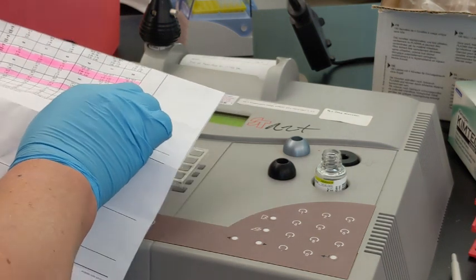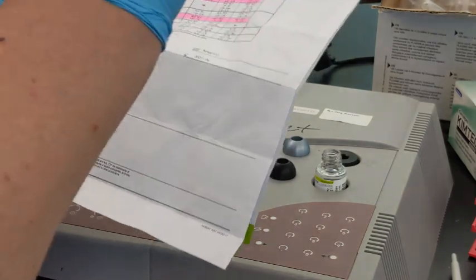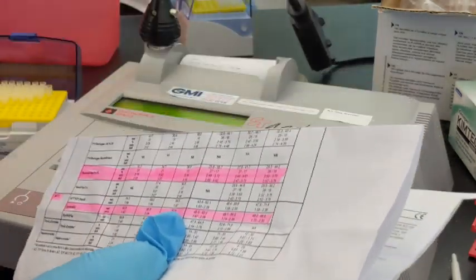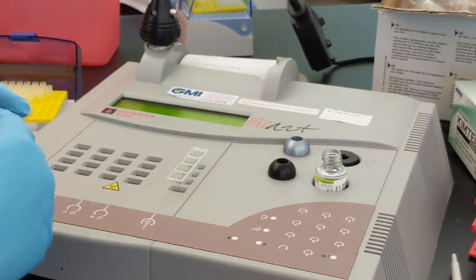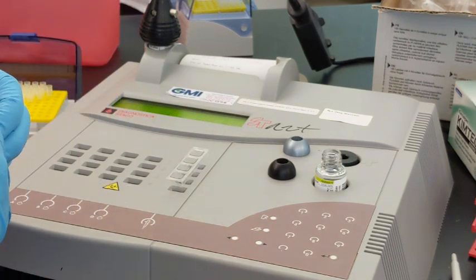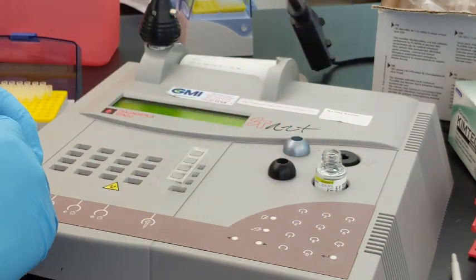So at 50.9, yay, I'm in. So if I were running patients' results, I could, with confidence, report that information. So this is, I hope, a good overview so that you can do this yourself during student lab.